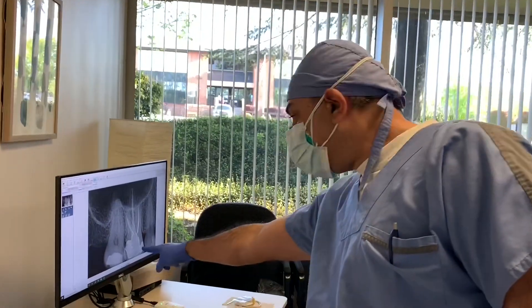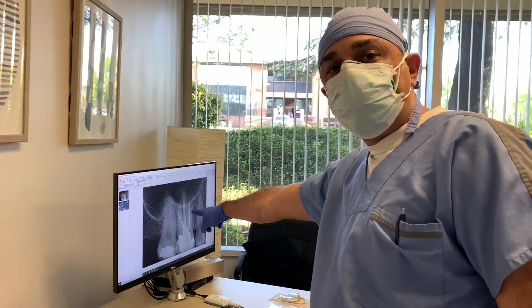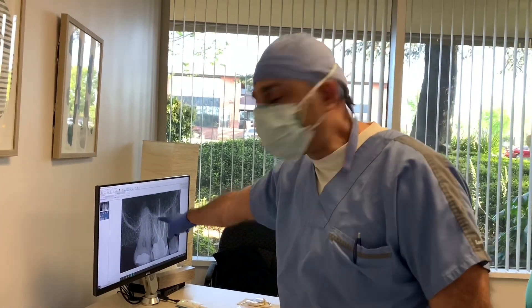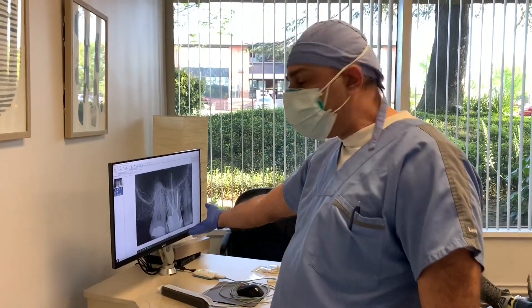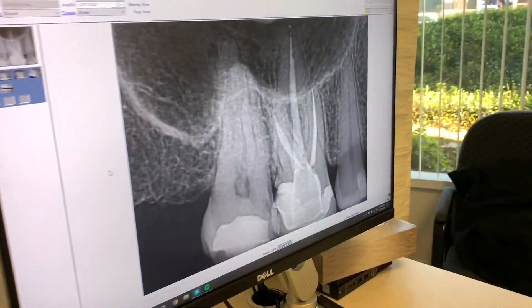Everyone, we're working on tooth number two today. We did tooth number three's root canal over a year ago and it's doing perfectly. Today we're working on tooth number two — diagnosis is irreversible pulpitis.